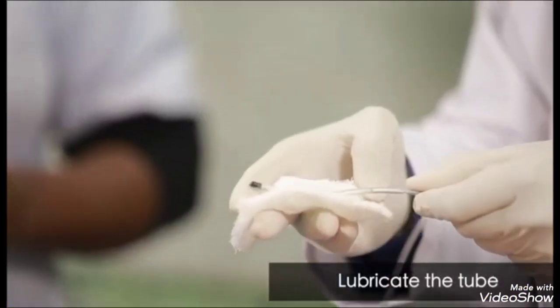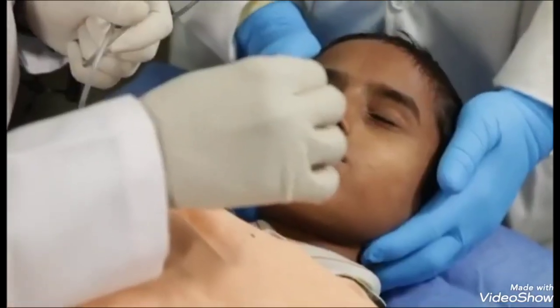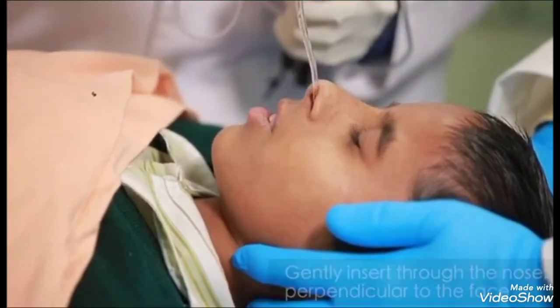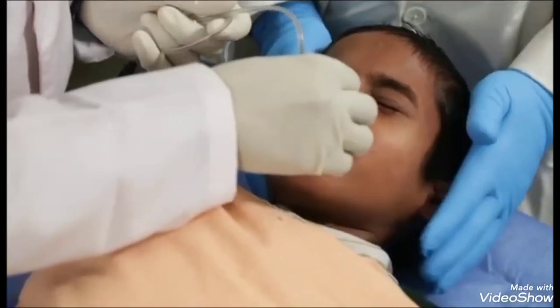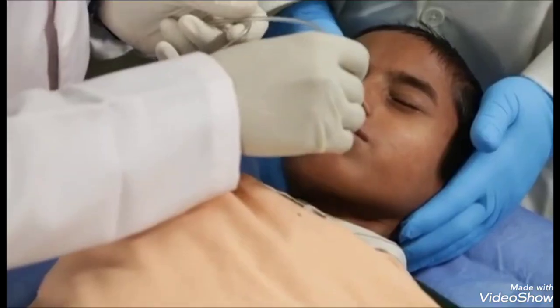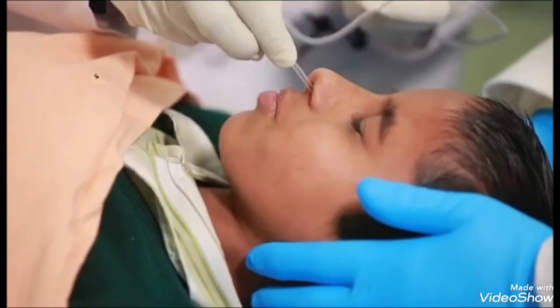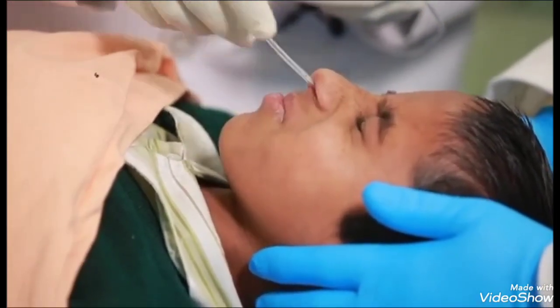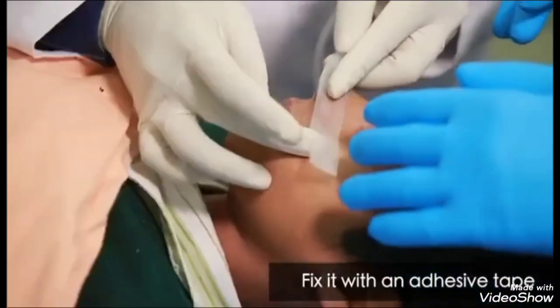Apply lubricant jelly to the tube. Gently insert the tube through the nose in a direction perpendicular to the face up to the measured length. This can often be assisted by asking the patient to swallow. Fix it to the nose with an adhesive tape.